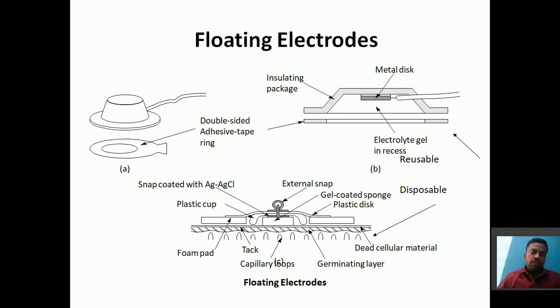With the previous types of electrodes, if we remove the electrode, the adhesive material is lost, so we need to use adhesive gel again. But with this electrode there is no need to do that, so we can move it anywhere on our skin. It has two types: snap-coated and the other type. Two types of electrode are there, and we will see them.